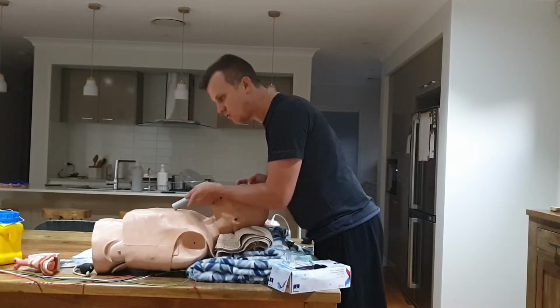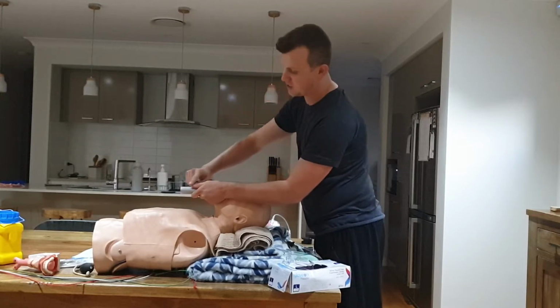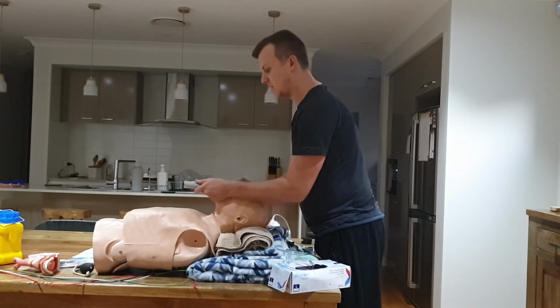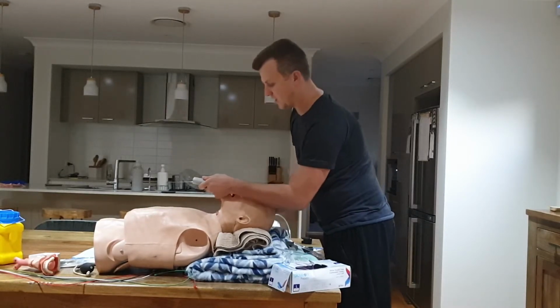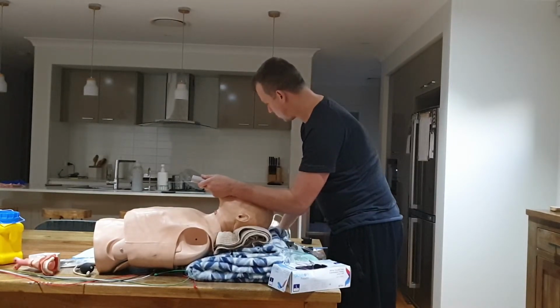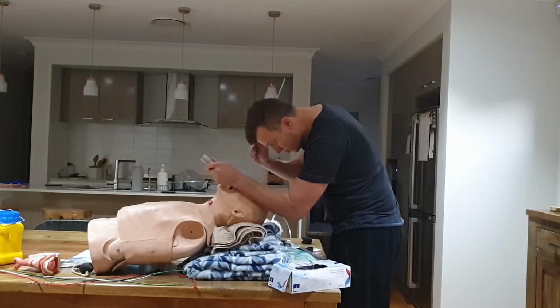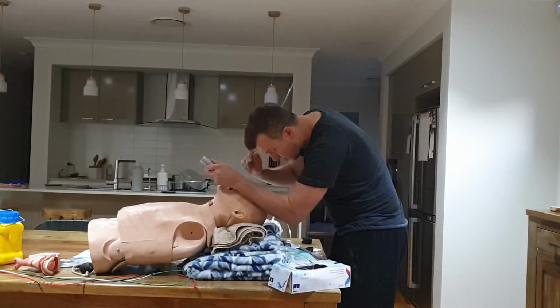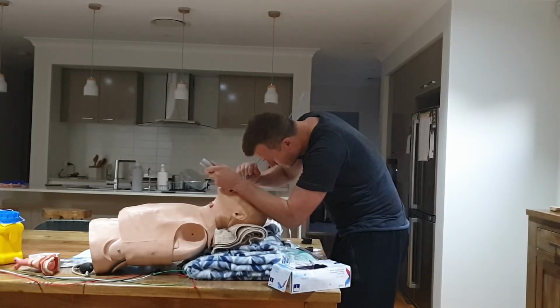Now you don't want to lever or pivot on the teeth here. So once you get it through and into position, I like to keep my thumb pointed towards the end of it. And when we have a little bit of a head tilt, that's the way you want to travel with the blade, with the handle. So with your non-dominant hand, just pull in that direction until you can expose the vocal cords, and then just feed the bougie down and pass it into the airway.